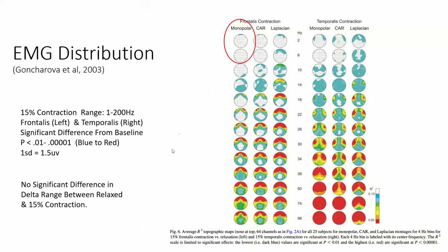You can see here that at this range, there's really no significance in the delta whatsoever for the most part, which is why I always say it's not likely going to show up on a map. These people would have to be really working hard, tensing profoundly and consistently, almost beyond the point of human endurance, to produce a significant signal. You'd have to be up in the 70 to 100 hertz range to get anything up here.